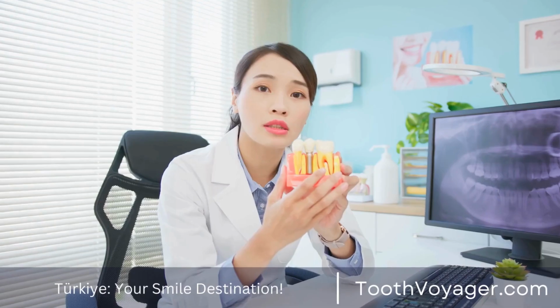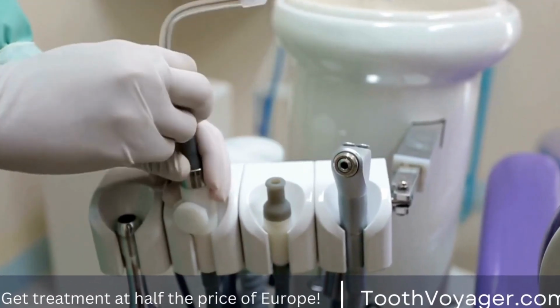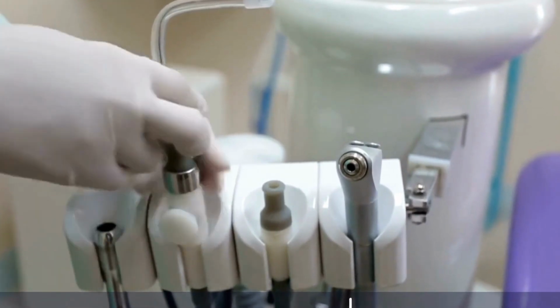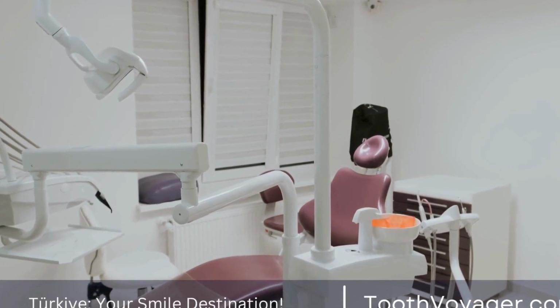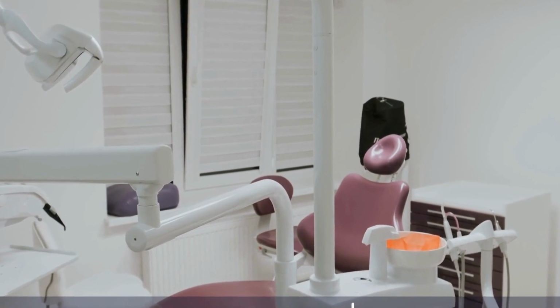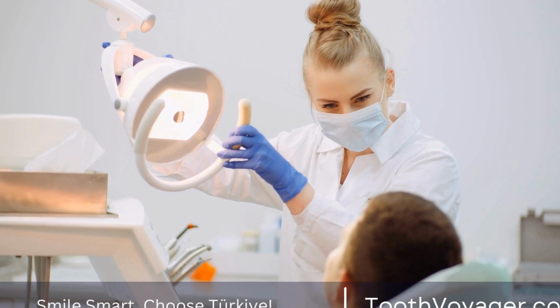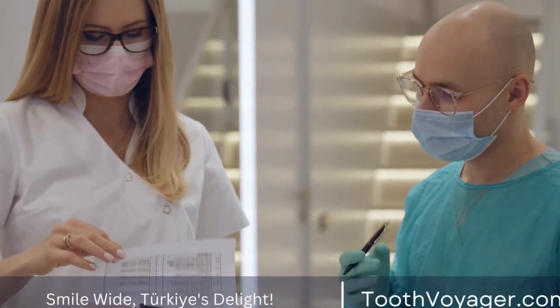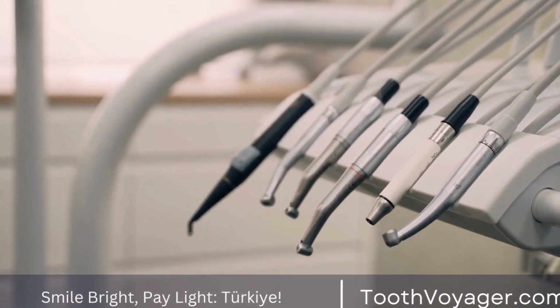4. Implant-supported dentures. Implant-supported dentures are one type of overdenture supported with dental implants instead of resting on gums as conventional dentures. This type of denture provides greater stability and a more secure fitting for dentures and reduces the chance of discomfort or slippage while eating or speaking. Implant-supported dentures are removable or fixed based on the needs of the patient and their preferences. These are typically utilized to substitute several teeth or a complete arch of teeth. They can enhance the function and appearance of your mouth.